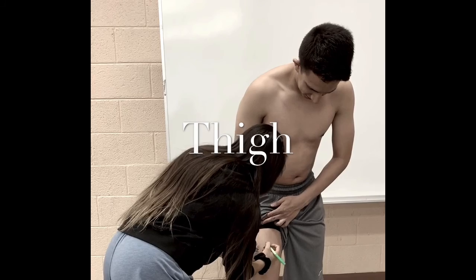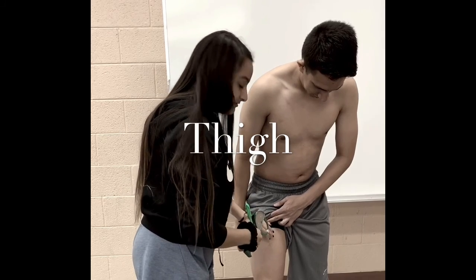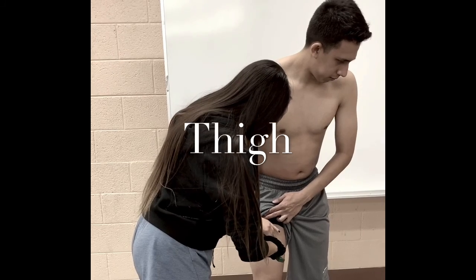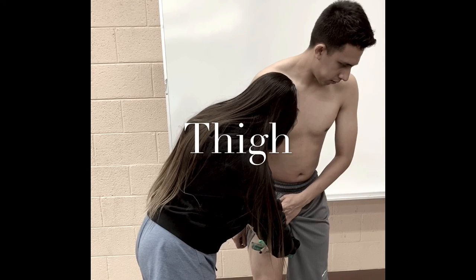The thigh is a vertical fold on the anterior midline of the thigh, midway between the proximal border of the patella and the inguinal crease. Have your client step on your foot in order to relax the thigh muscle so it can be easier to pinch.